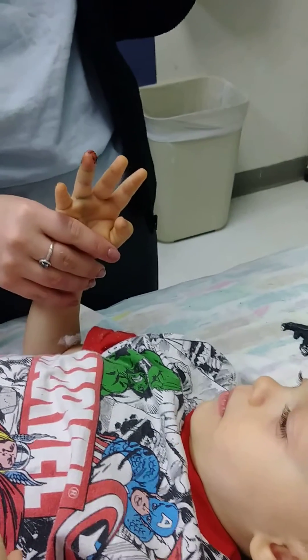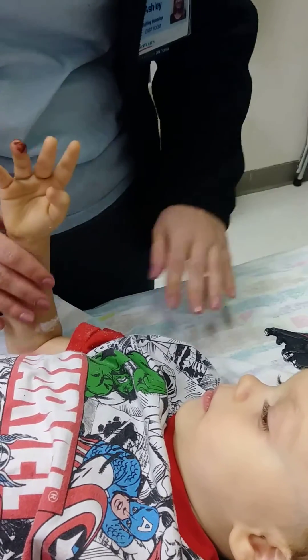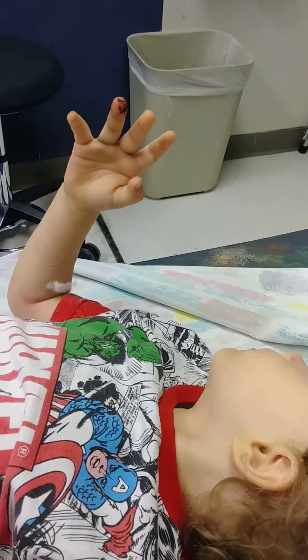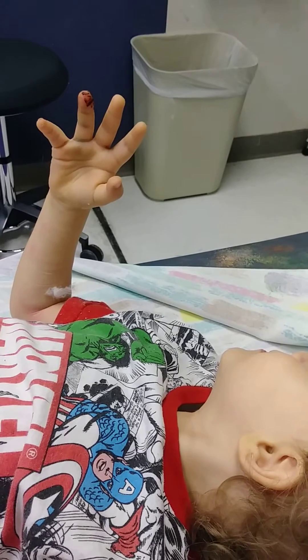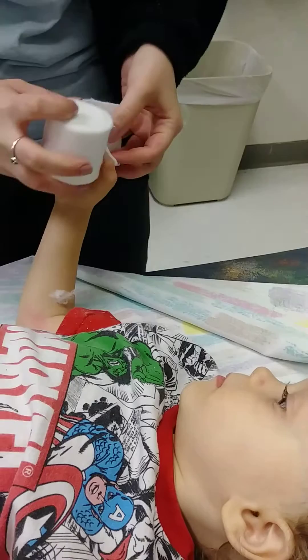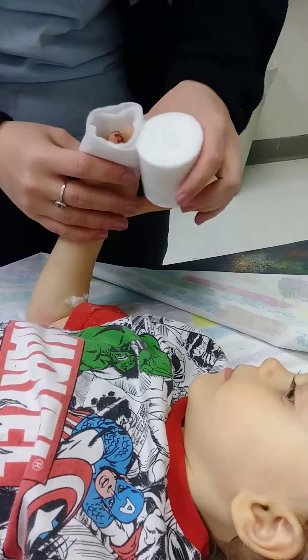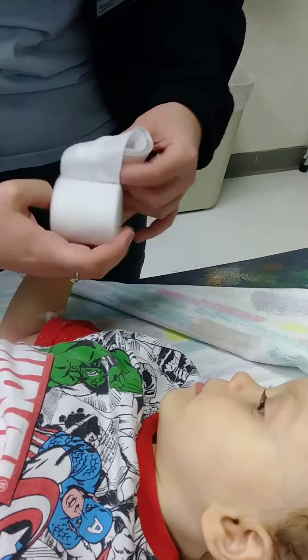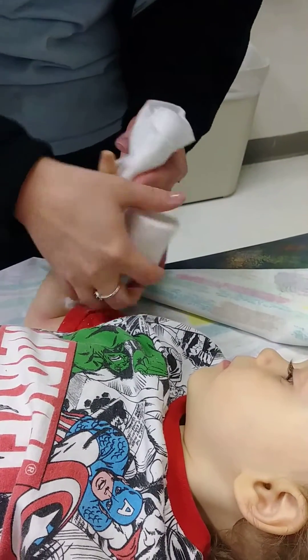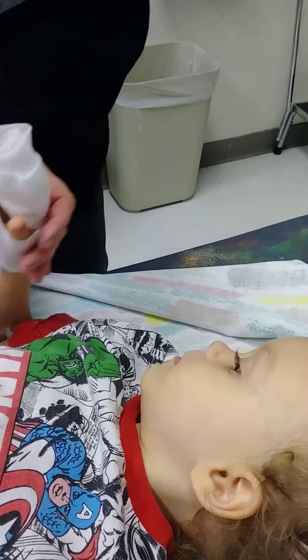Wow, there's a hand! Yeah, it looks weird huh? Looks good from that side. Don't touch it, Karen. Did it look pretty good from the other side? I think most of what I was seeing was the stitches. All right, put your hand on your belly.